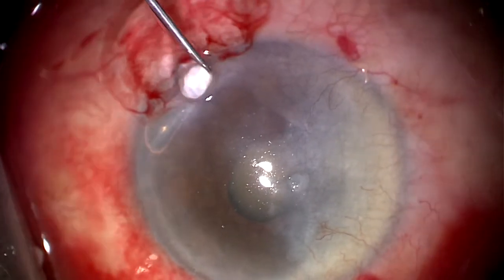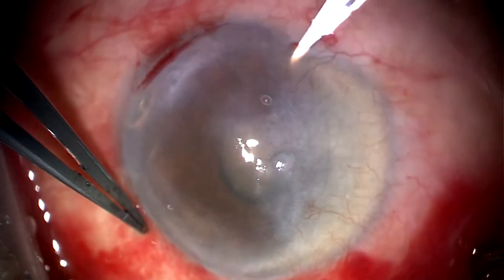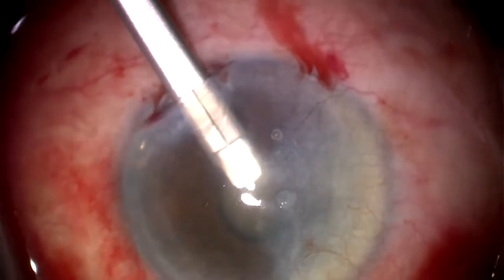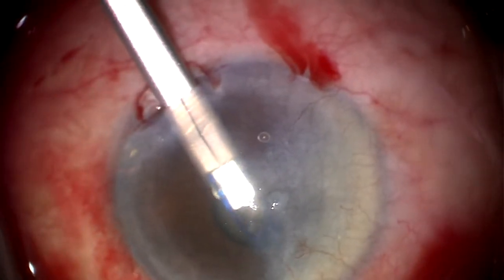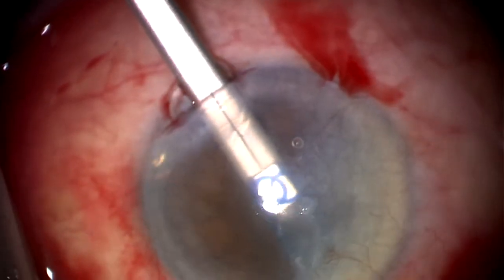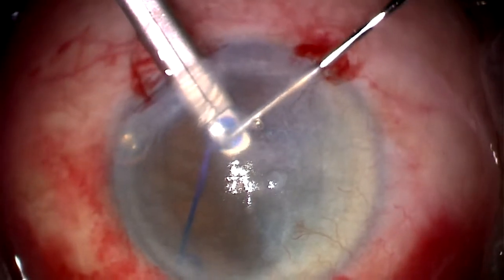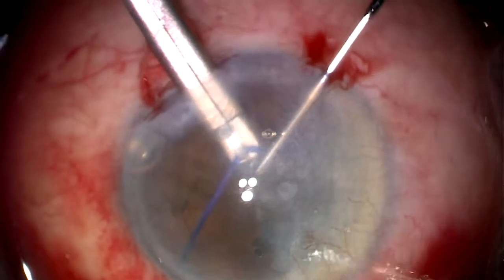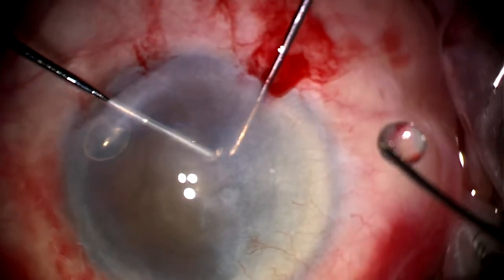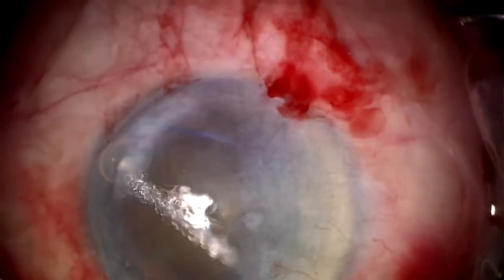In this case, we'll use a pupil expansion device, which I prefer — in this case it'll be a Malugin ring. The ring is now being deployed here. The distal part of the ring goes out and engages with the iris. As the remaining rings are deployed, a bimanual technique was required in order to facilitate engaging the iris because the view was rather compromised, particularly at the top. You can see us using two instruments to get optimal fixation.